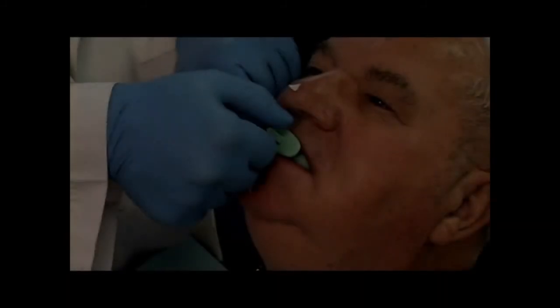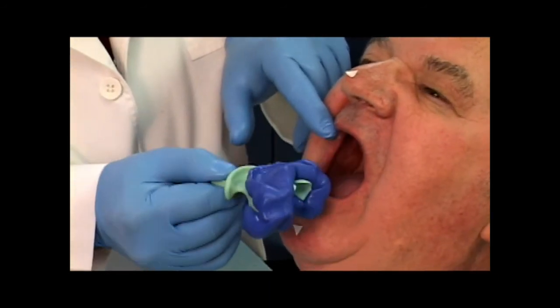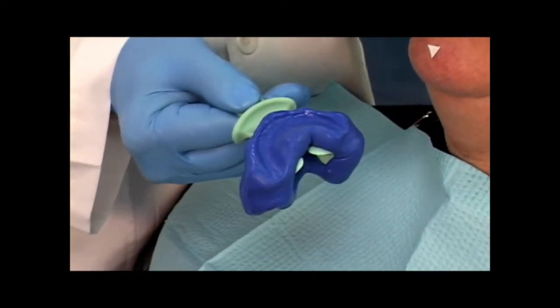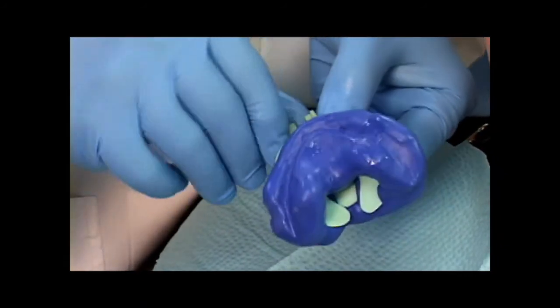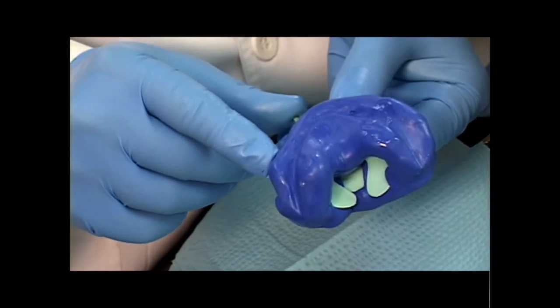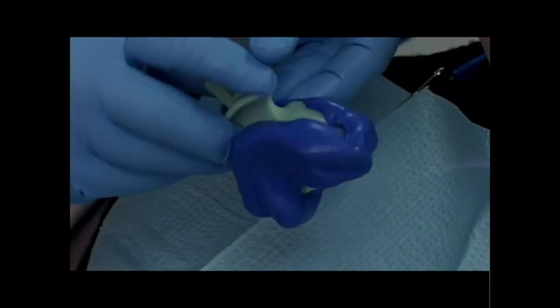The patient remains in this position for approximately 2 minutes until the material has set. There should be a reasonable recording of the maxillary and mandibular ridges, and preferably there should not be any areas where the tray has poked through the putty registration material.